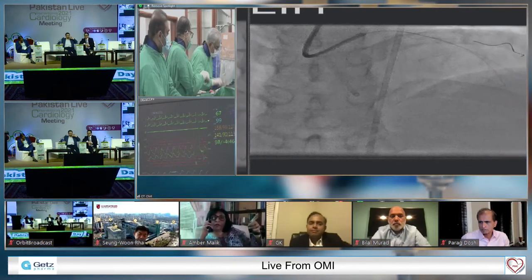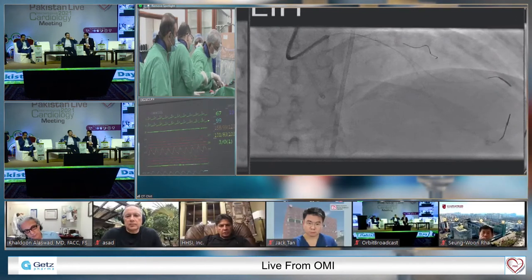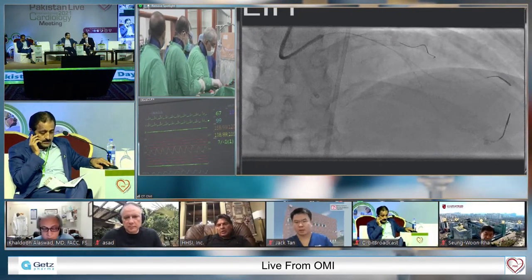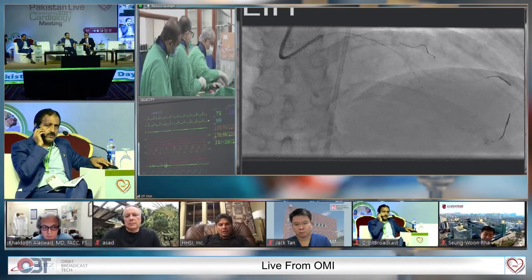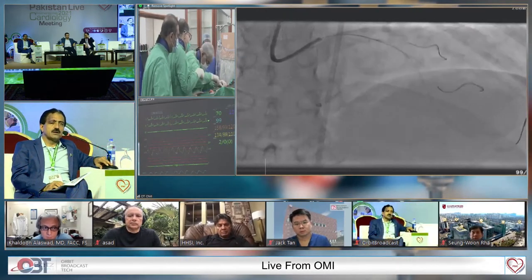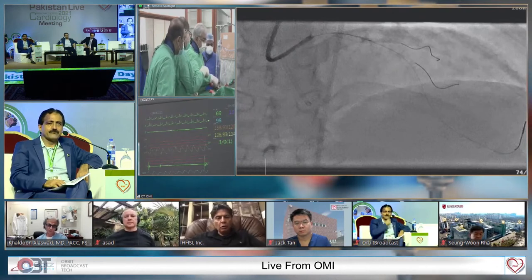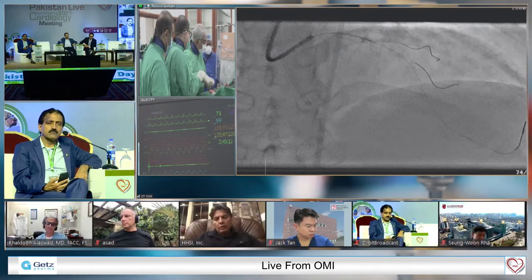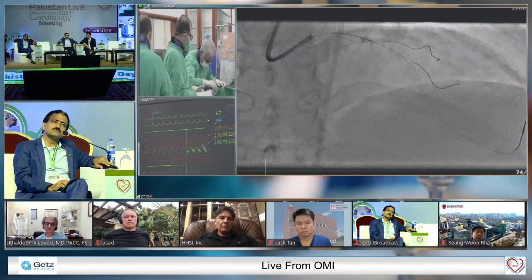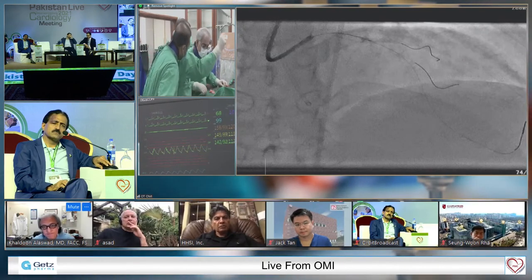Just to follow up on Dr. Al-Sawadi's thought process, we have done IVUS, and even in the distal vessel, all 100% of our CTOs, we do IVUS or OCT, and we've gone back in 3 to 6 months to relook at them, and the stent at that point is under-deployed, because what has happened is positive remodeling has occurred, and the stent that we thought was the right size at the time is not at that point. So we've actually redilated. Can you speak a little louder? So I was just following up on Dr. Al-Sawadi's point that because of this no flow going through there, the distal bed is usually smaller than what it would be in 3 to 6 months. And even the actual lesion, the stent that we put in and check with OCT and IVUS, sometimes when we go back 3 to 6 months, is smaller, and we have to redilate the stent to upsize it to the newly positively remodeled artery.